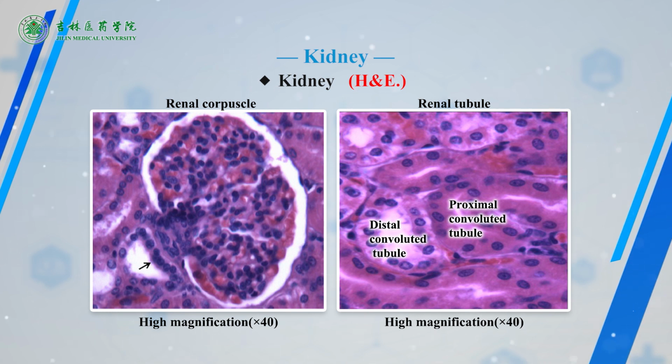It's difficult to separate them from the endothelial cells. The cavity between the parietal layer of the capsule and the glomerulus is the capsular space. Examine the renal corpuscle on the slide carefully.